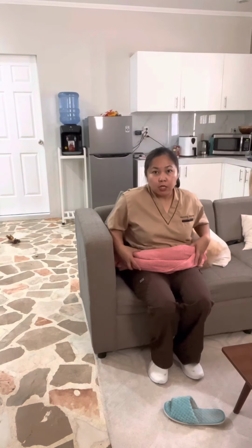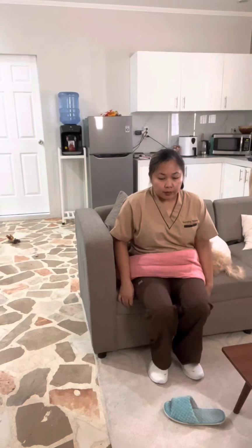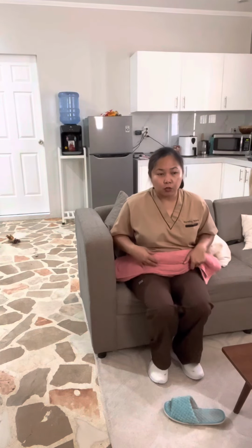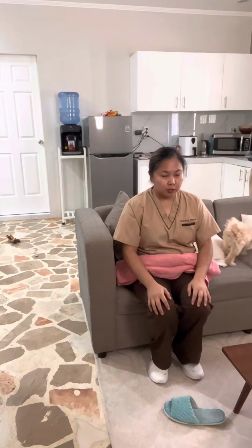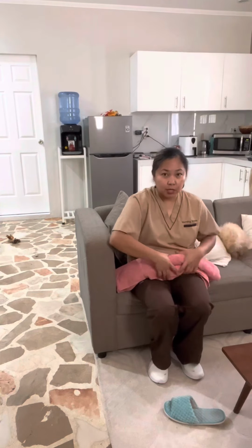So let's just pretend I'm the patient and I have the gait belt on me already. I would let the patient be on the edge of the bed or the chair, whichever position they are in, and make sure that they're ready to stand up when you have this gait belt. This gait belt will be very useful for them to get up, by you as a nurse pulling them up using this. But make sure that you're in front of them when you're doing this procedure. That way they could easily hang on to you just in case they get out of balance. So let's say there's a nurse that's going to pull this gait belt for me, so I could get up.